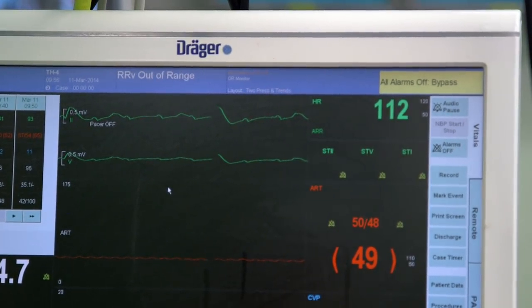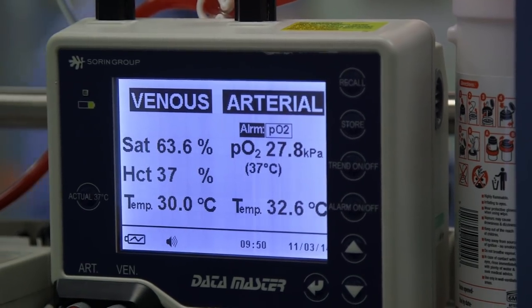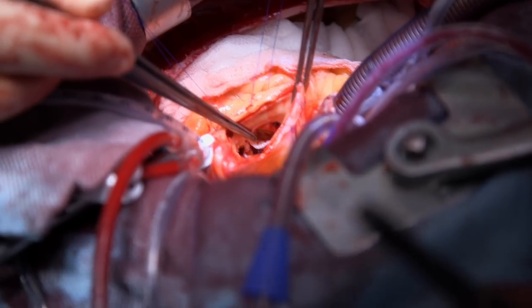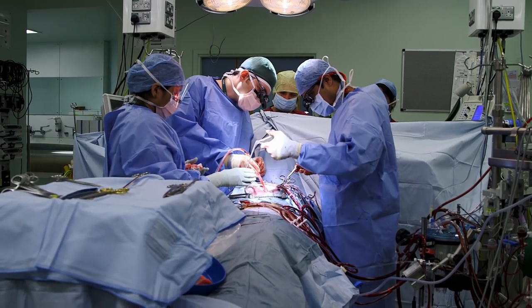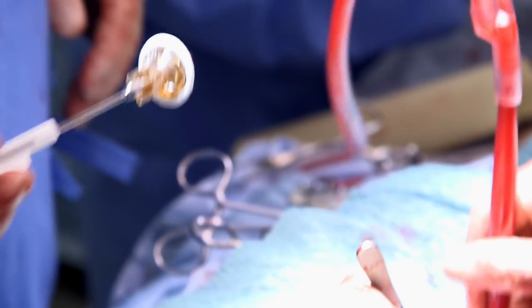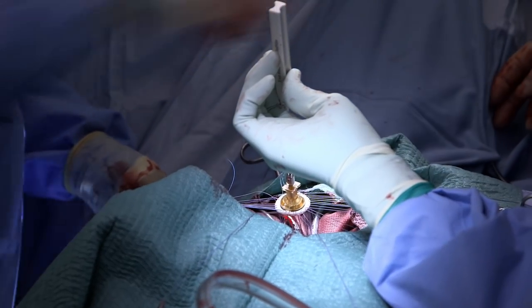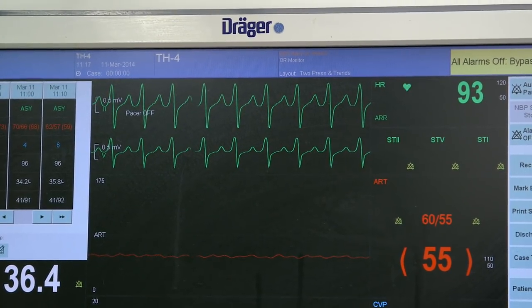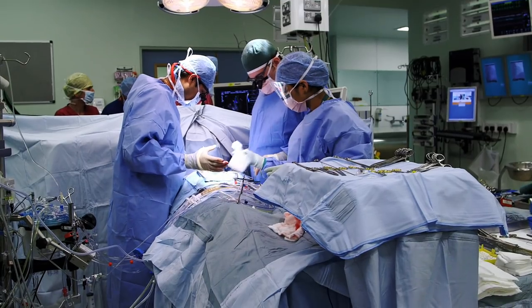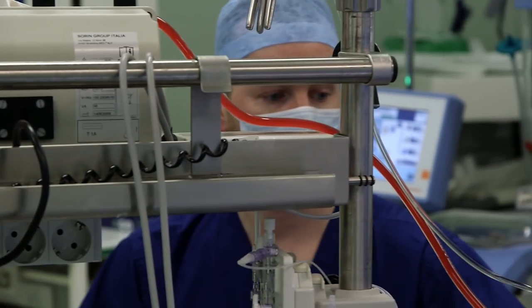The heart is stopped now, you can see here. Put some blood through now. The valve is exposed, so I'm going to have to cut it out now, okay? Then I have to size the correct size of the valve to stitch in. Once that is done, I have to close the chamber before restarting it. There you are, you can see the ECG. It's almost a regular rhythm now. And then I have to come off the bypass machine and close the chest. That's off bypass.